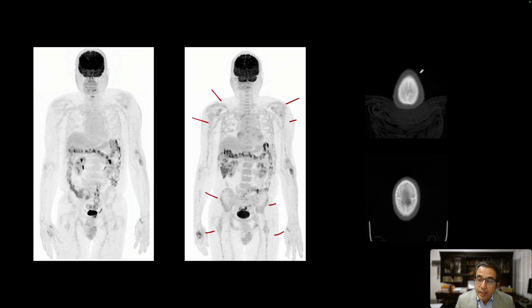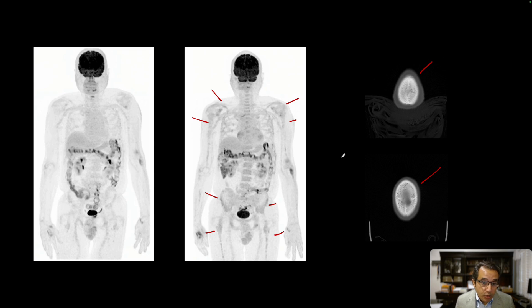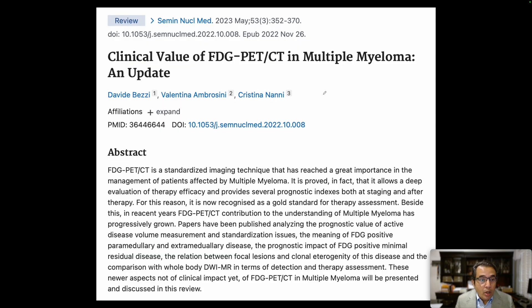CT images at the level of the skull from the prior and current study show more numerous tiny lytic lesions in the skull from multiple myeloma. FDG PET-CT has a very important role in multiple myeloma: localizing bone lesions, assessing degree of hypermetabolism, and localizing soft tissue lesions called plasmacytomas. This case illustrates how mild uptake can be suggestive of multiple myeloma. A great article on the topic is: 'Clinical Value of FDG PET-CT in Multiple Myeloma: An Update.'